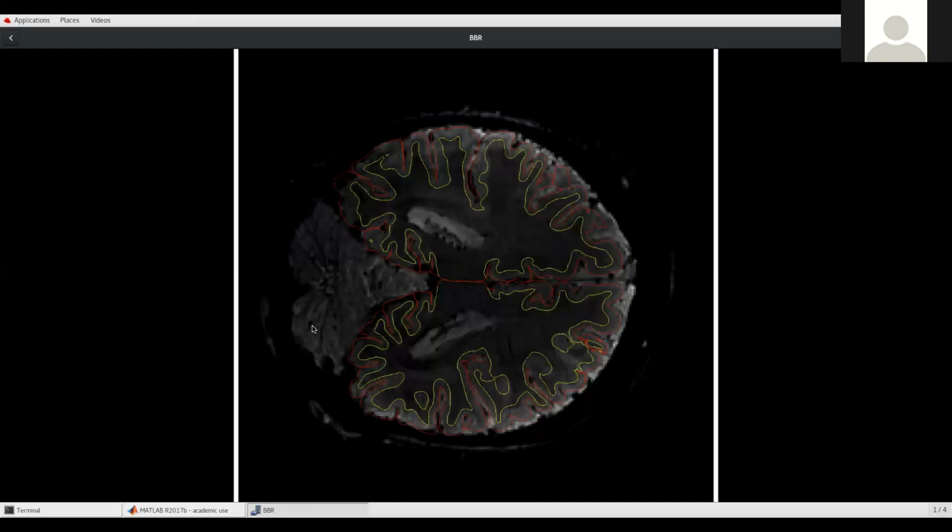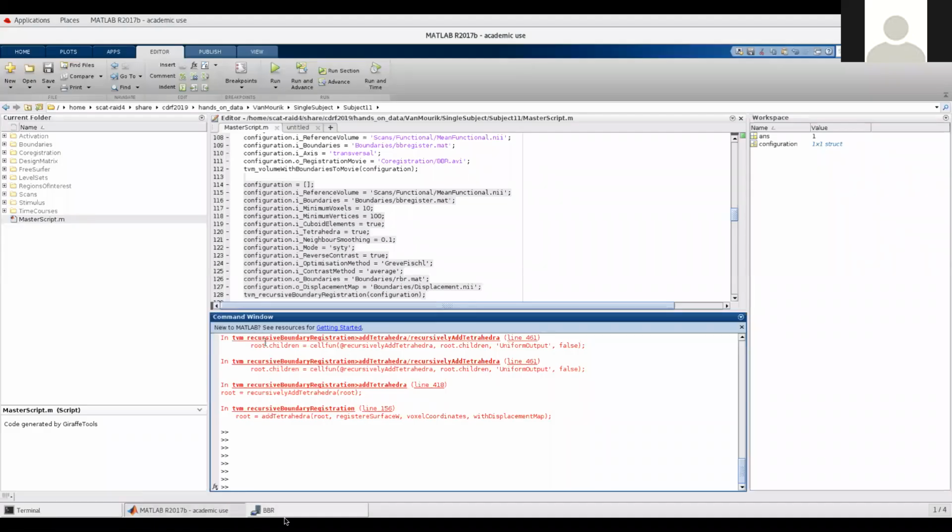Yeah. But I guess the question is, you would inspect the data, change the level of recursion on a per-subject basis for some subjects. To me, layer analysis is a lot of inspection of the data and changing parameters, cost function parameters, whenever needed. Yes, that's right. Okay. Can I ask a follow-on question to that? Yes. Which is, how do you inspect the data efficiently and fairly? I'm doing registration, subjects data, and how do you know when your registration is good enough?